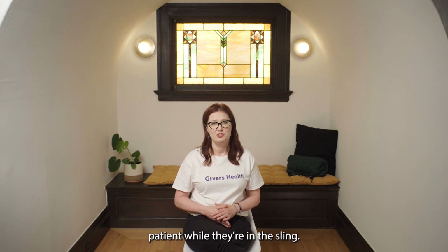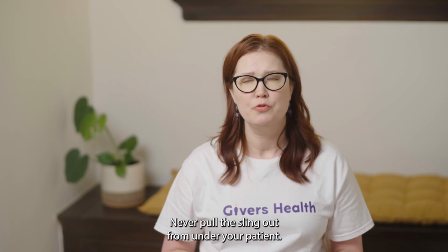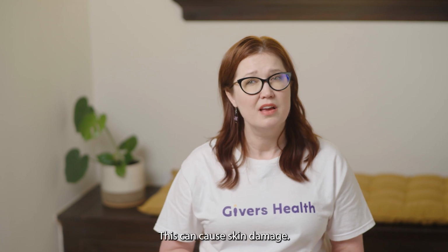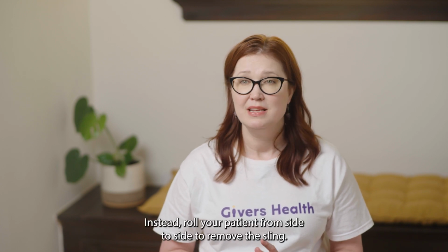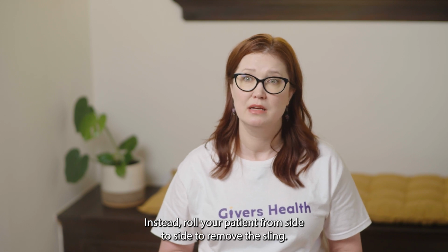Always stay with your patient while they're in the sling. Never pull the sling out from under your patient. This can cause skin damage. Instead, roll your patient from side to side to remove the sling.